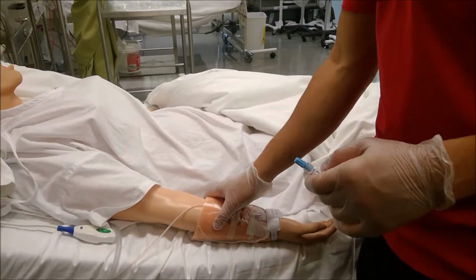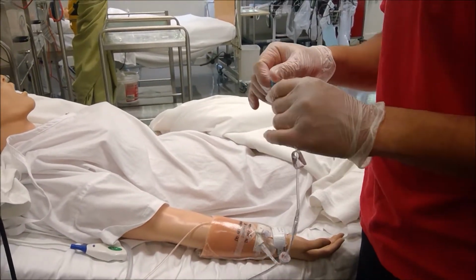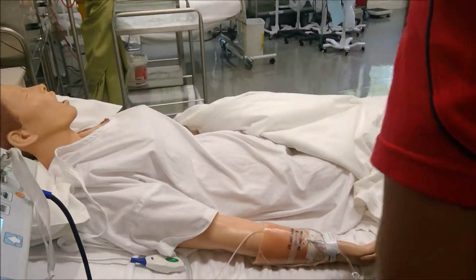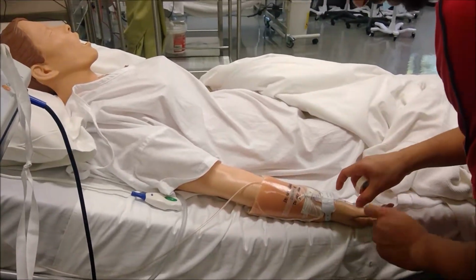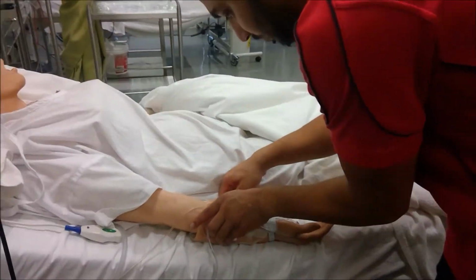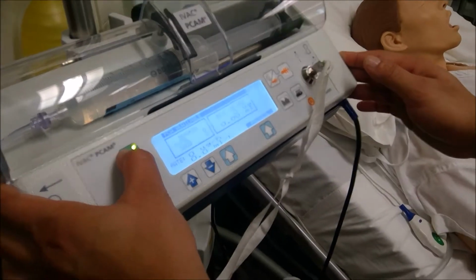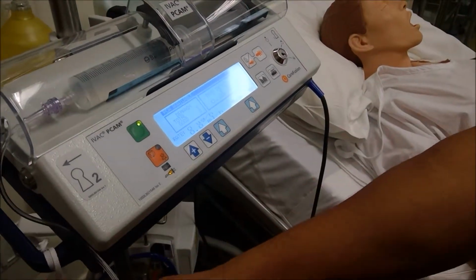Okay, so we've done a vital sign check on you, and everything checks out. You're within range for the medication. So I'll connect the PCA line. I'll just secure the line. I'll give you your education. Press start. Okay. Remove the key.